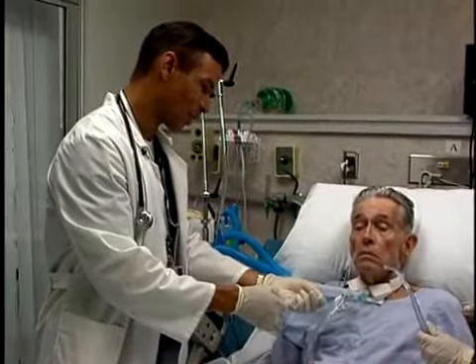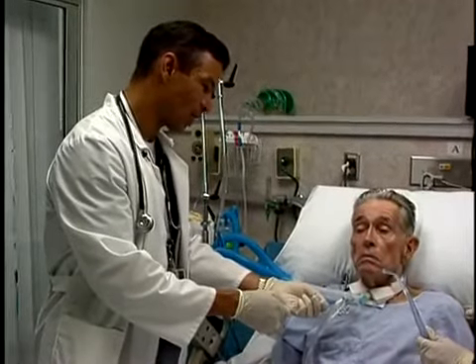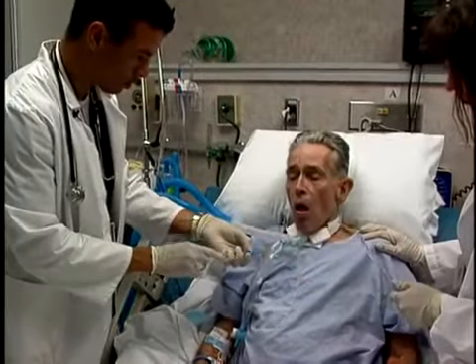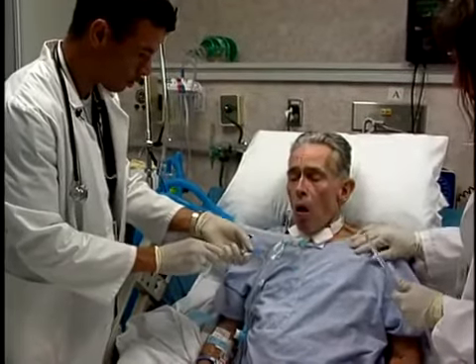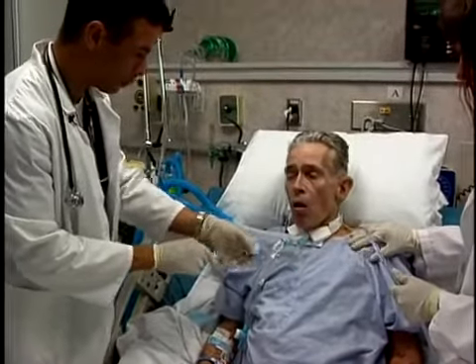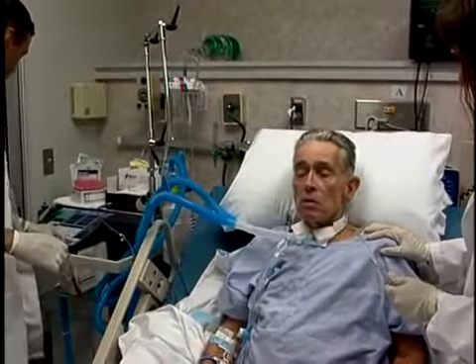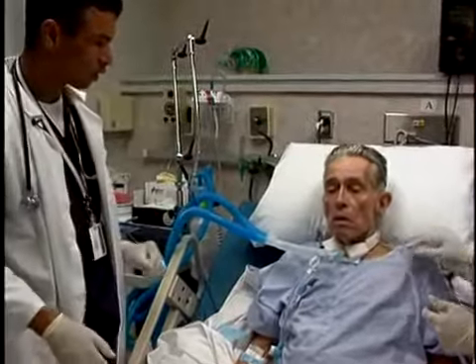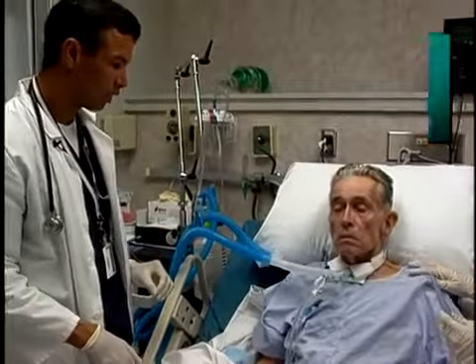If it is determined that the patient cannot tolerate cuff deflation initially, for example, due to risk of gross aspiration or need for intensive critical control over mechanical ventilation, the patient should be reassessed for cuff deflation as changes in his or her medical condition occur. An alternate means of communication should be provided to the patient in the interim.